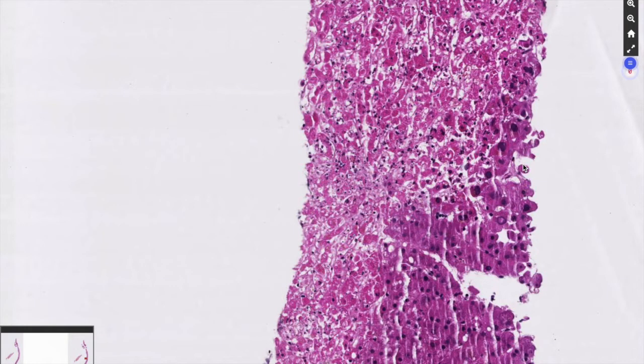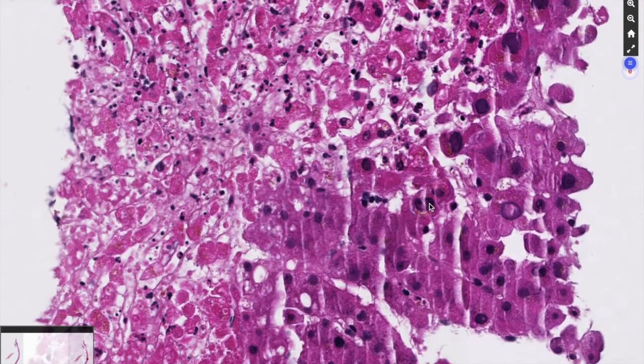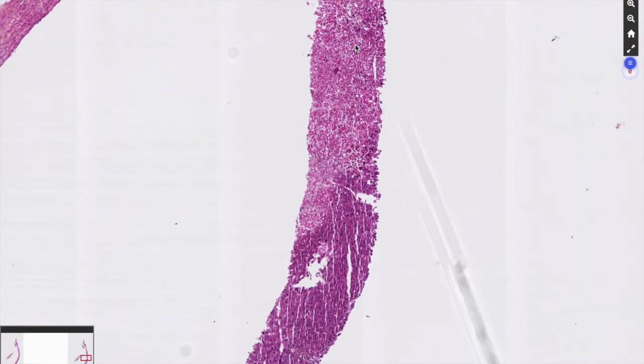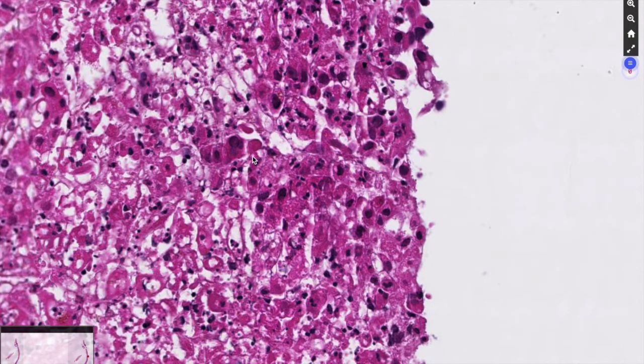So this patient has acute fulminant hepatitis due to herpes simplex virus. And this kind of presentation with a micronodular appearance has been reported, and so you have in the liver multiple nodules of necrosis, and you can identify the viral inclusions in the hepatocytes that are located next to the necrotic nodules. It is a very aggressive disease with a lethal outcome in most of the cases.